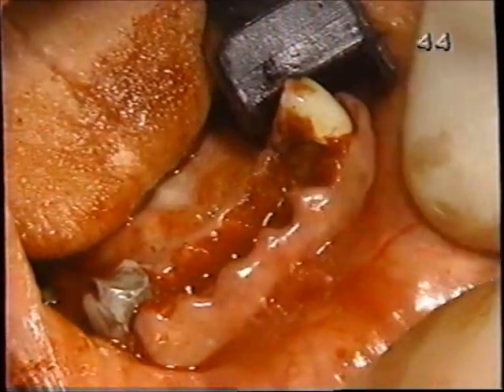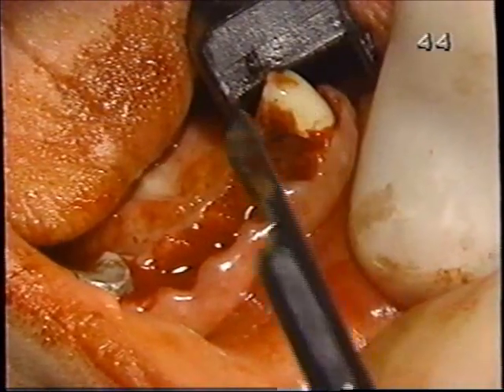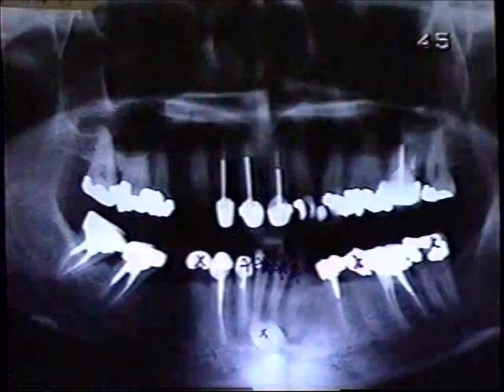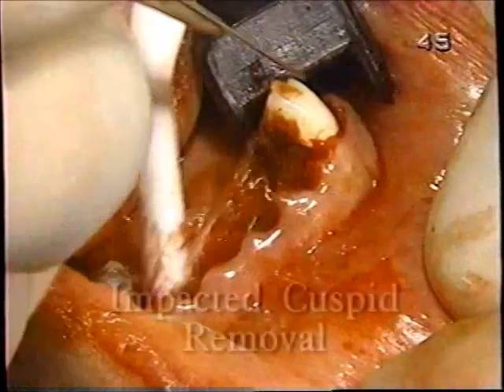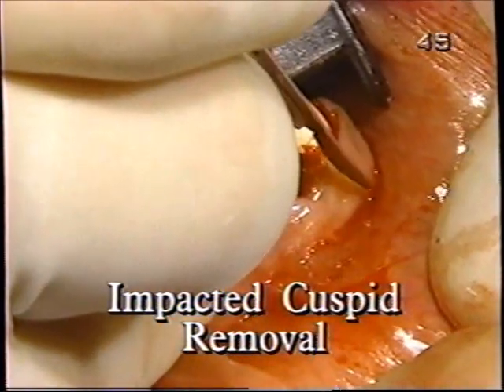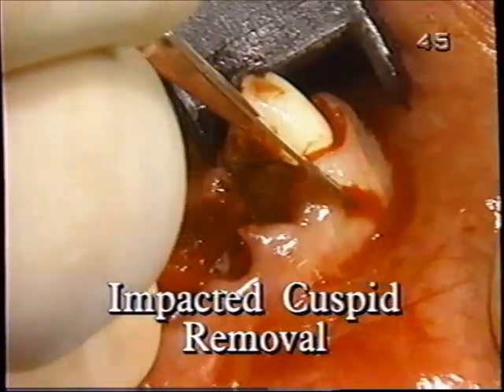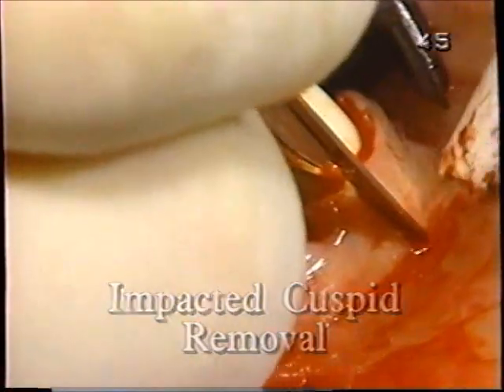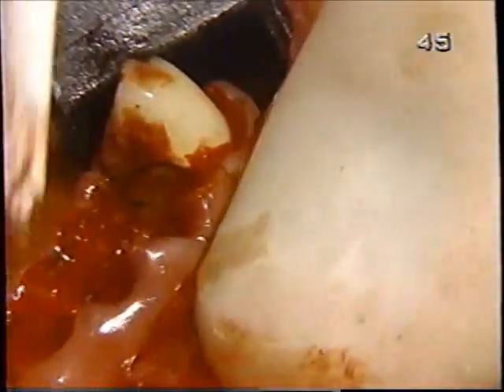We're now going to remove the impacted or unerupted canine, number 27, that according to x-rays is right beneath where number 24 and 25 were. We're going to start by making another releasing incision right here, to give us the access and the visibility we need.